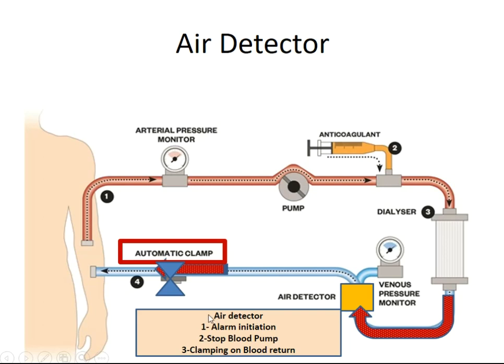The air detector will induce 3 steps: producing an alarm, stopping the blood pump immediately, and clamping the blood return.